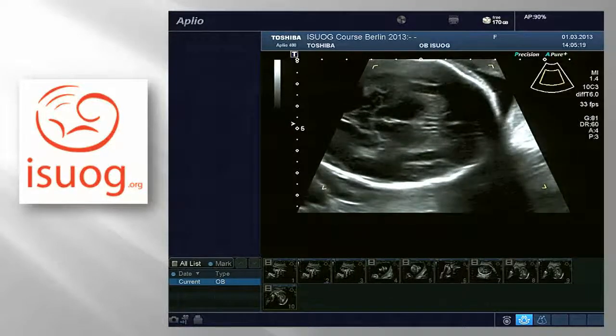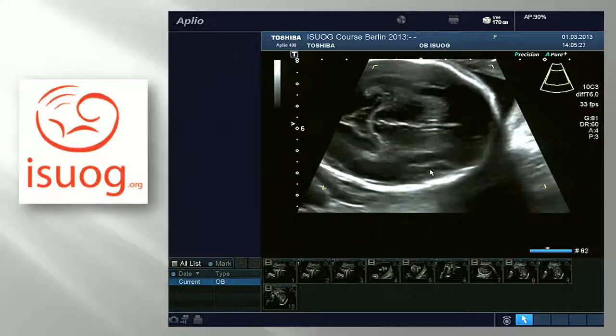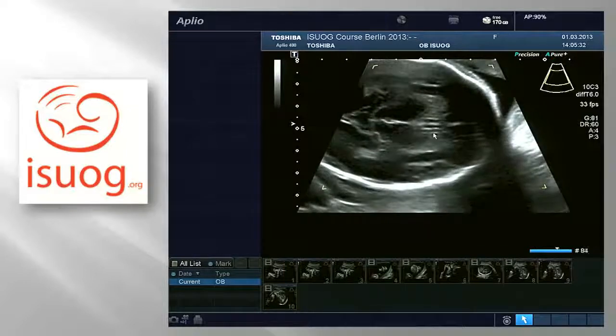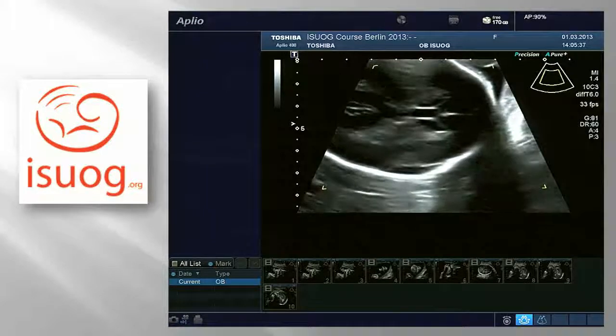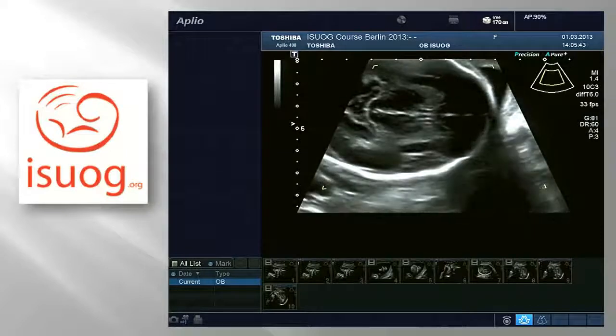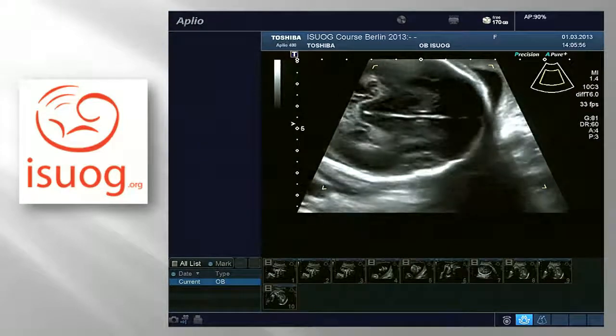Okay. Do we agree that this is rectangular, but it is not the cavum septipellucidi? Just 3 lines. These are the columnae fornices. So I'm starting from top, cavum septipellucidi, frontal horns, and these are the 2 columns of the fornix and the midline in between. At this level, you don't see the frontal horns anymore. So you should not mistake these with the cavum septipellucidi.